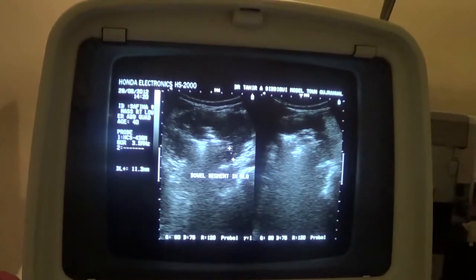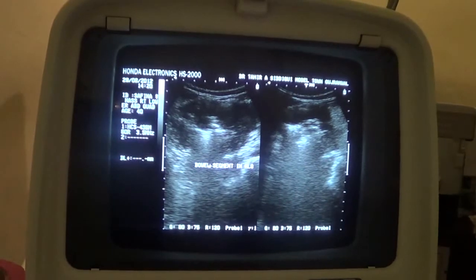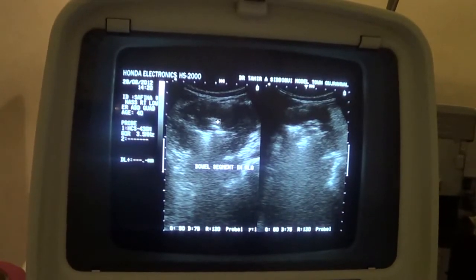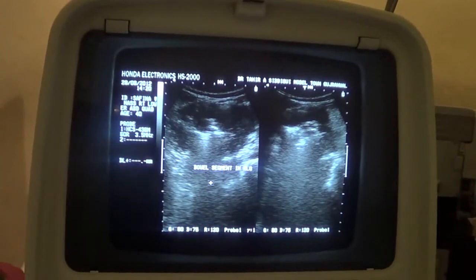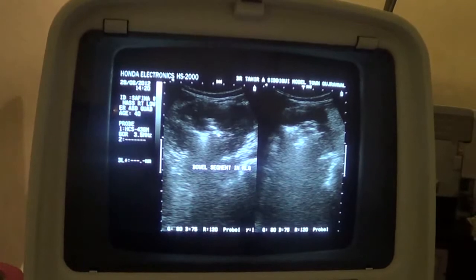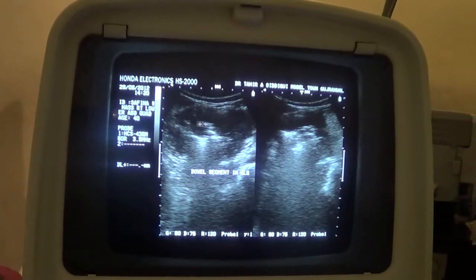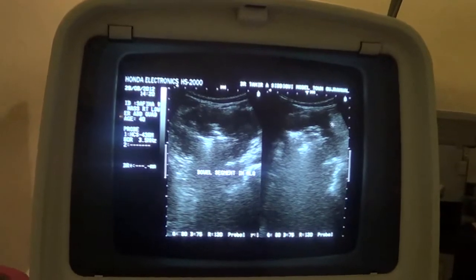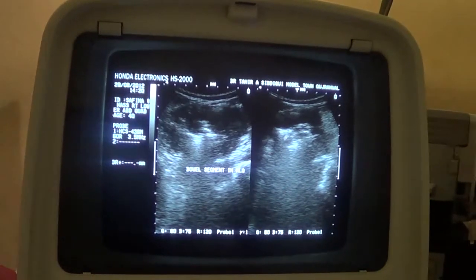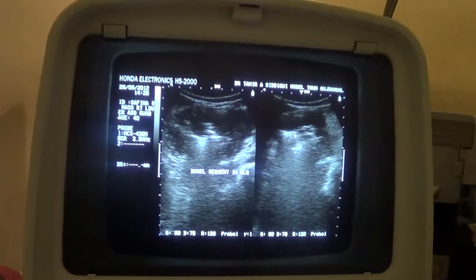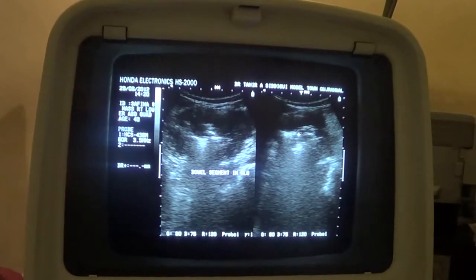The wall thickness is approximately 11.3 mm. Normal should not exceed more than 5 mm. There are bowel gases within the lumen. This black area of the bowel segment is the wall, and this bright echogenic area with posterior shadowing is the trapped gas within the lumen of the bowel segment.